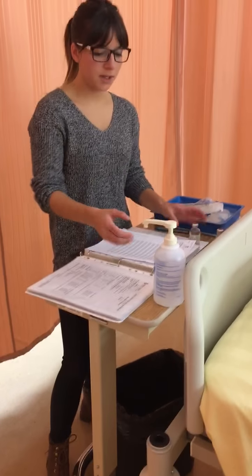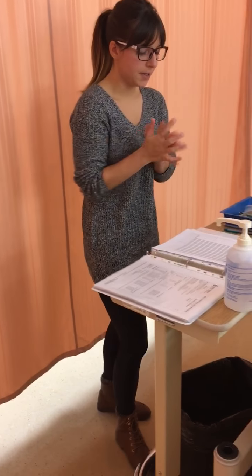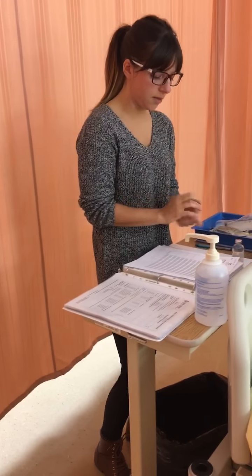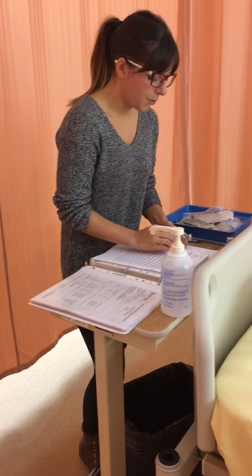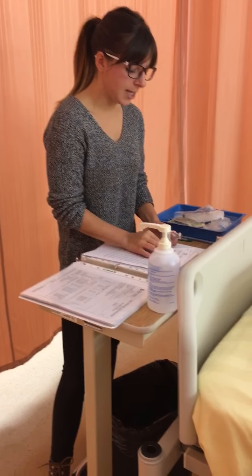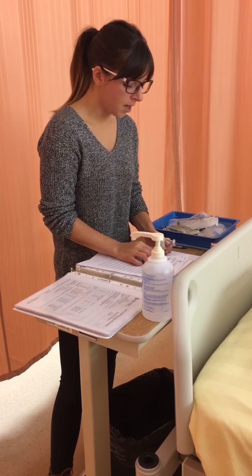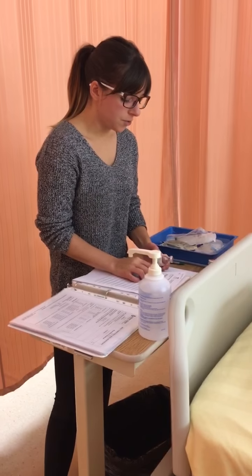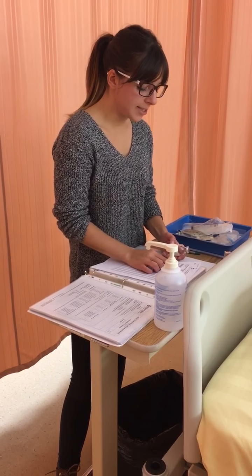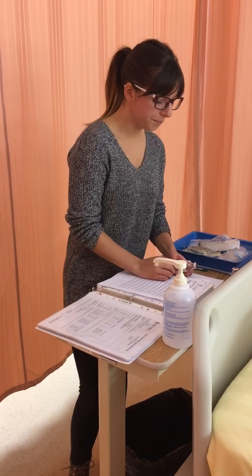Before I do anything, I'm going to want to wash my hands. Okay, so we're going to do our first med check by comparing the vial with the MAR. Right drug, penicillin. Right dose is 4 million units, and the vial says 5 million units, so we know that's going to have enough that we need. The right route is IV, the right time is 11:30, and the right patient is Pablo Pitts, whom I'm going to be administering this to.